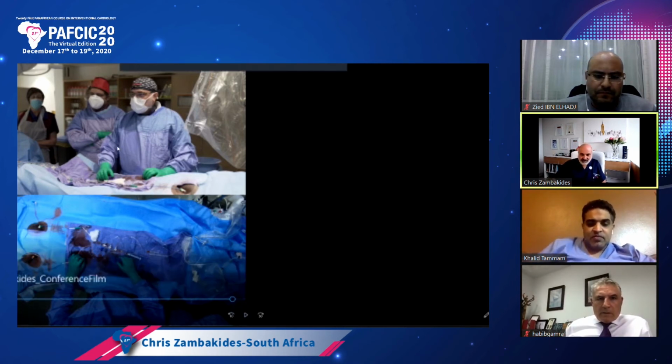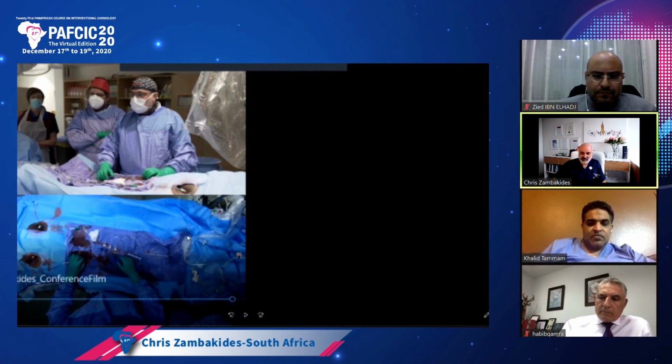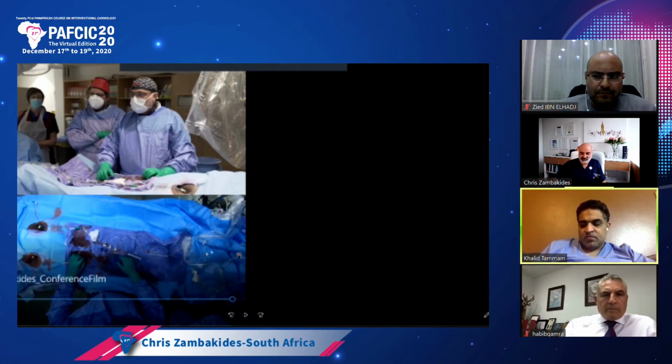Yeah, so it's important. I agree with you there. You as the operator should be aware of it, but sometimes if you forget, whoever you're working with, you should make them very conscious and aware, because sometimes you're so busy and absorbed with where your wire is and where the tip of your microcatheter is that you're not looking. So my assistant and especially my technologist, as soon as he sees any damping of pressures, is going to shout at me and say, listen, pressures are damped, what's happening? You really need to be aware of that, because that's where you can ruin a case.